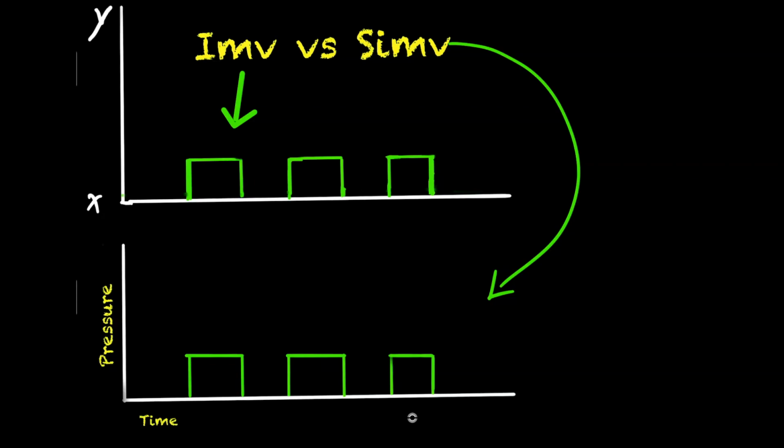What I want to do is show you what happens when your patient may be getting a little light and tries to take a spontaneous breath during the surgical procedure. So here, these little blue half circles are trying to display a spontaneous breath taken by the patient.